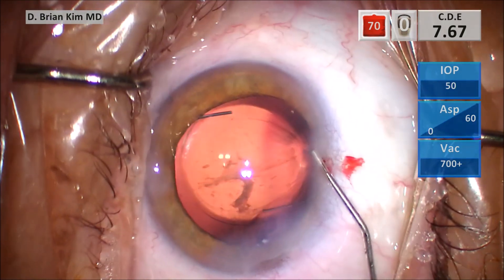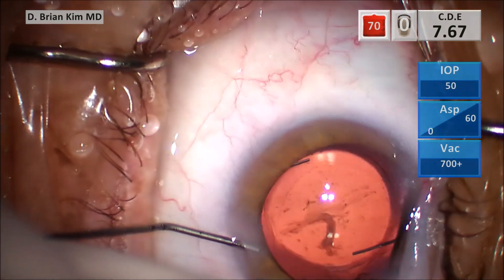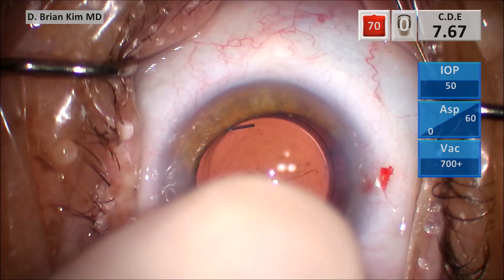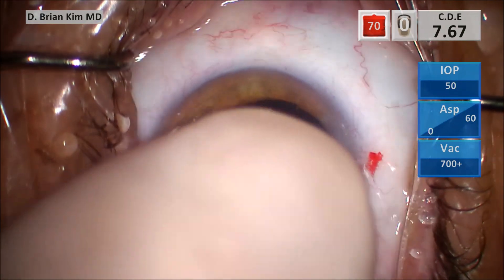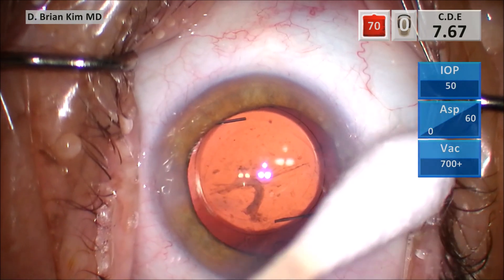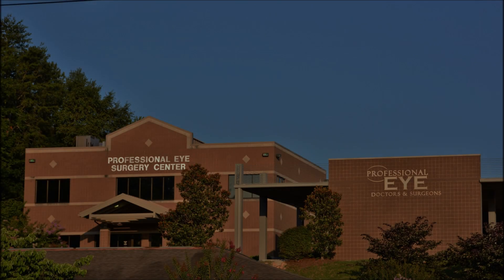I hope that each of these signs of zonular weakness and zonular dehiscence will help you for your future cases. This was not a case of significant zonular dehiscence — you didn't need any more support, and you didn't see the bag flopping backward into the vitreous space. A capsular tension ring plus the three-piece lens was more than adequate to provide stability. Long term, if there's a dislocation of the lens, you can use a CTR lasso suture to fixate it to the sclera. I hope this was helpful — thank you for your attention.